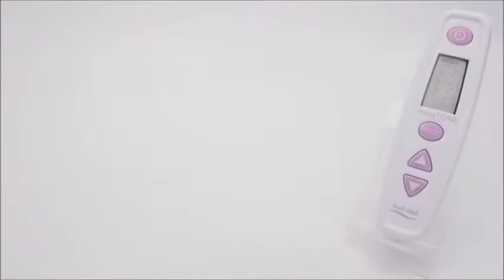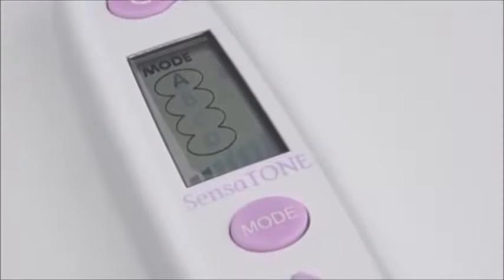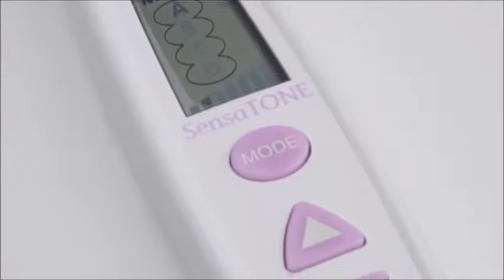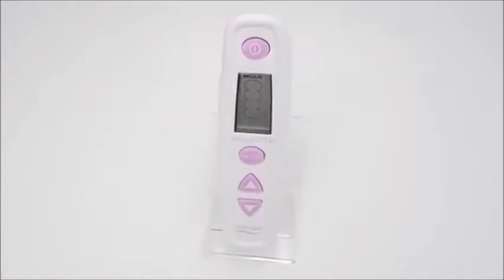Hi, my name is Paddy and today we're introducing the Sensitone from Babycare 10s. The Sensitone is an ultra simple yet powerful digital pelvic floor stimulator. It is an ideal device for strengthening pelvic floor muscles by simulating Kegel exercises. It is compact, stylish and designed for women of all ages.